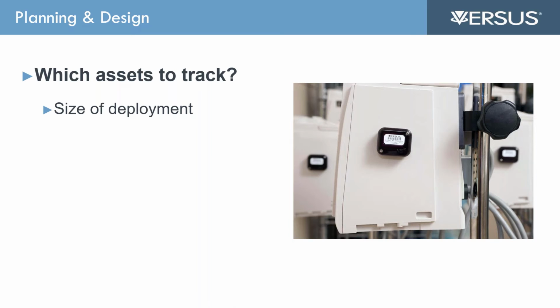So what equipment is going to be traveling throughout? What equipment may actually be local? Oh, this bladder scanner never leaves labor and delivery. Or this piece of equipment is specific to cardiovascular care in the ICU. And understanding too, then, where it's utilized.